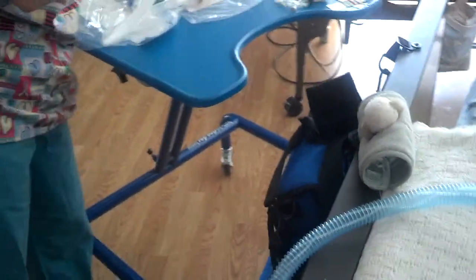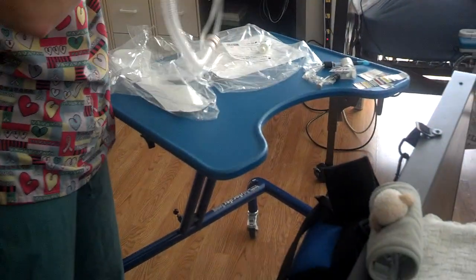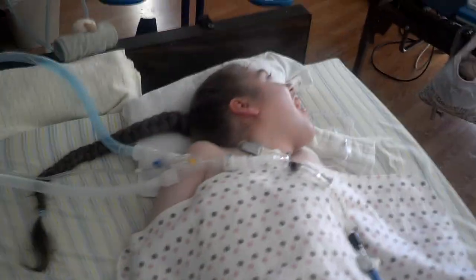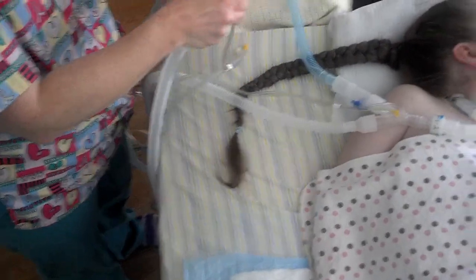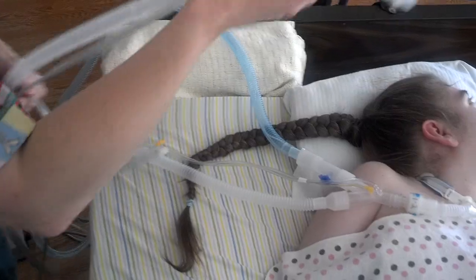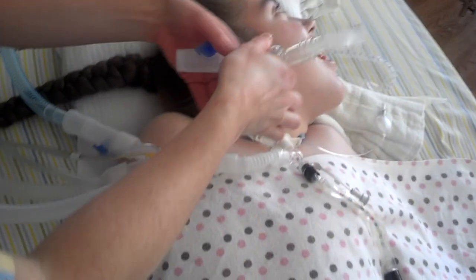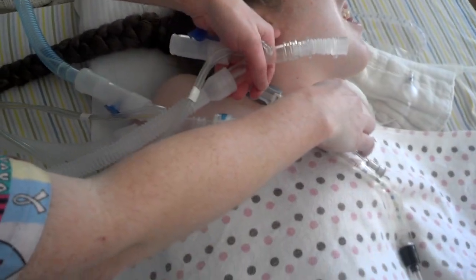Now she's going to do the white. Do you do patient end or machine end first? I do patient end. So we have the new MDI on the Y joint waiting to be attached to the blue, and she's already put the flex tube connector at the end of her Y joint.